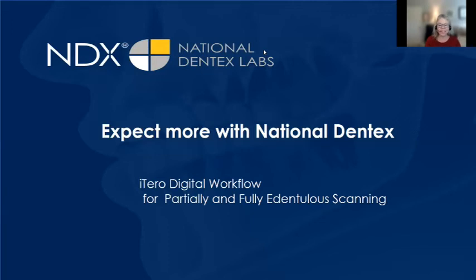Welcome. This is the iTero digital workflow for partially and fully edentulous scanning.